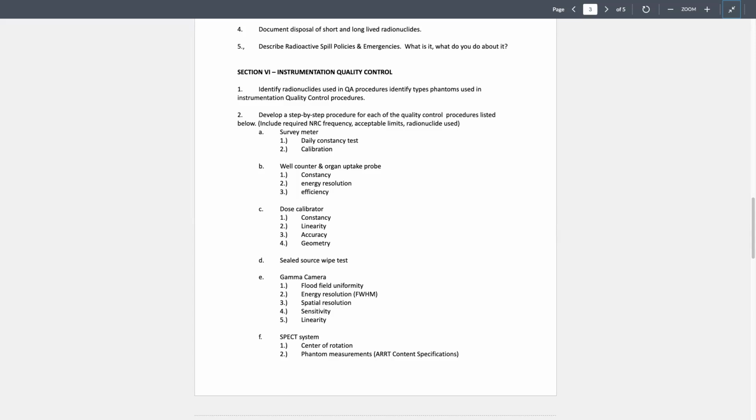If you have a gamma camera, there are going to be things that you do or don't have, but at least cover these things. Along with that, what will be a part of this section is the quality controls that you do daily on your gamma camera. What do you have to do daily? What do you have to do weekly? What do you have to do monthly?